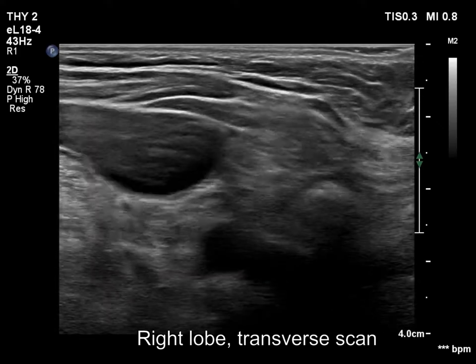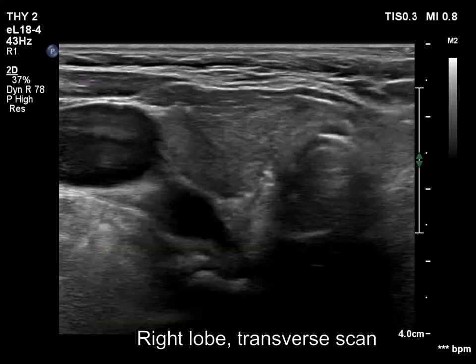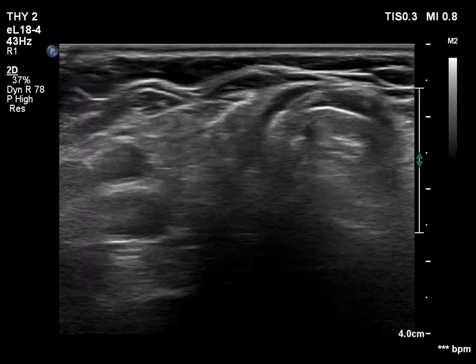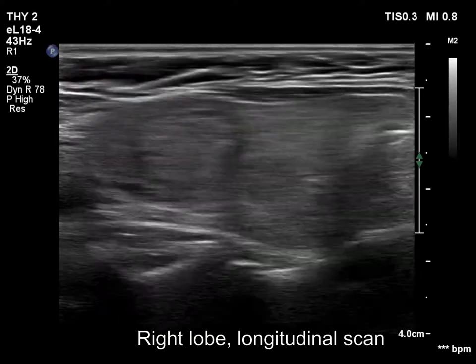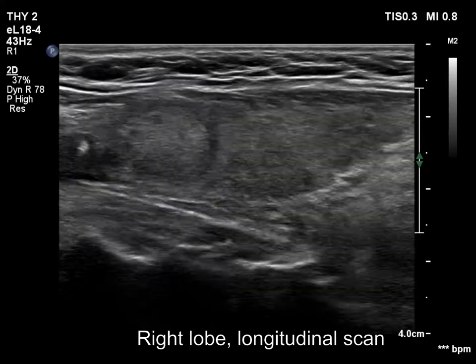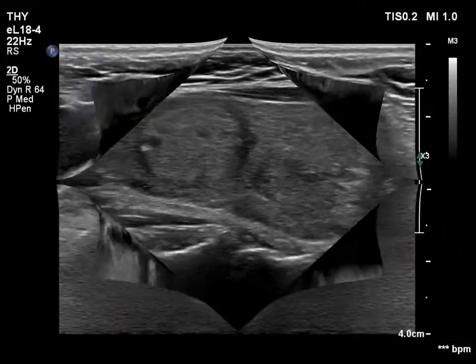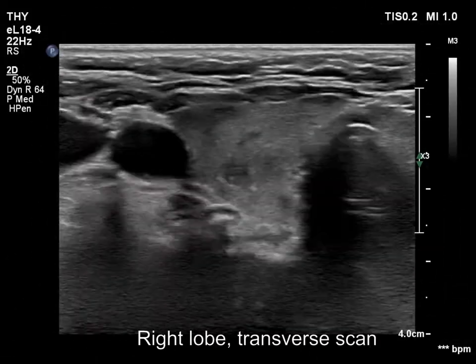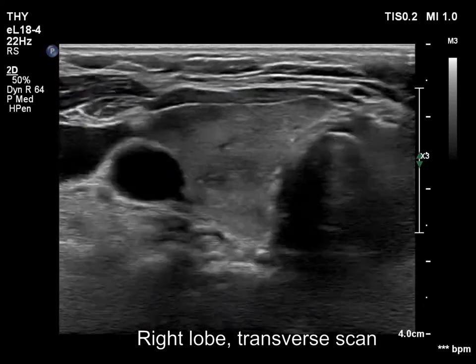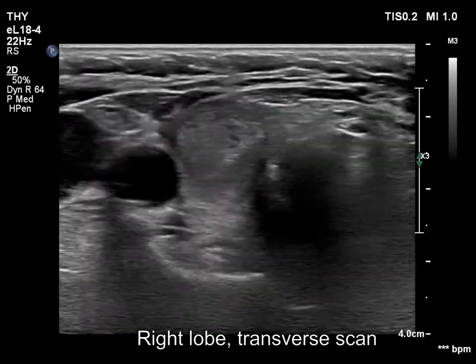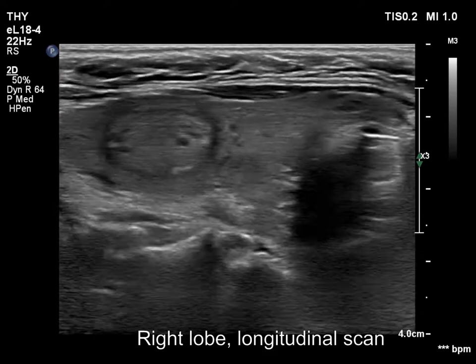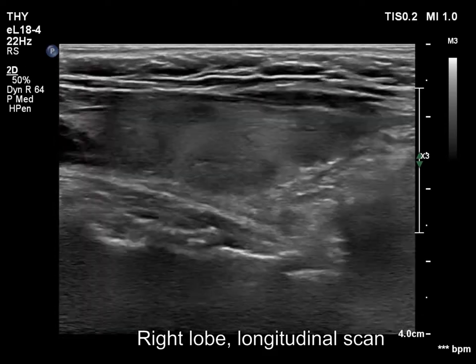The thyroid is echonormal or minimally hypoechoic. There is an echonormal or a bit more hyperechoic nodule in the upper middle part of the right lobe. The nodule has a halo. Now with a more harmonious setting, although the lesion has tiny hypoechoic areas, the lesion should not be regarded as heterogeneous.